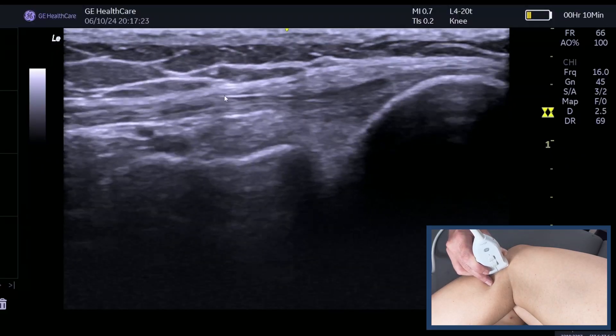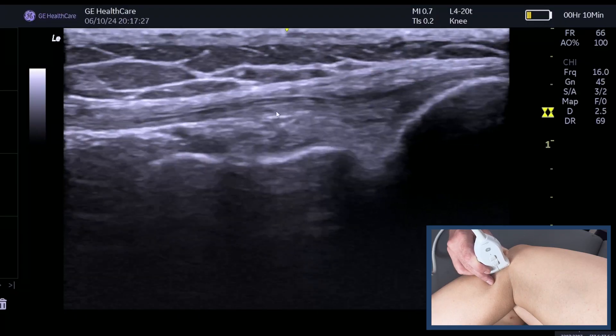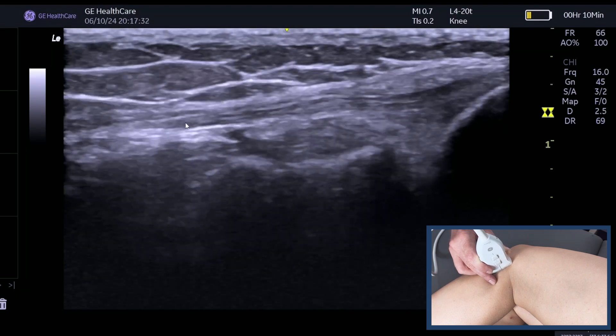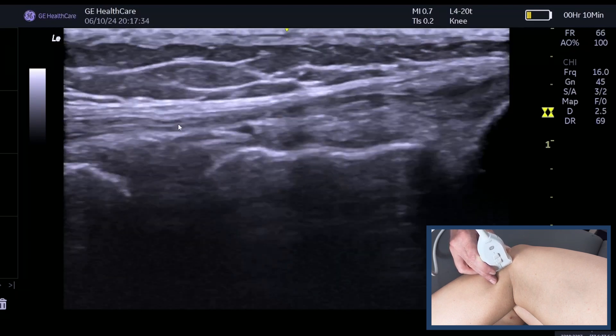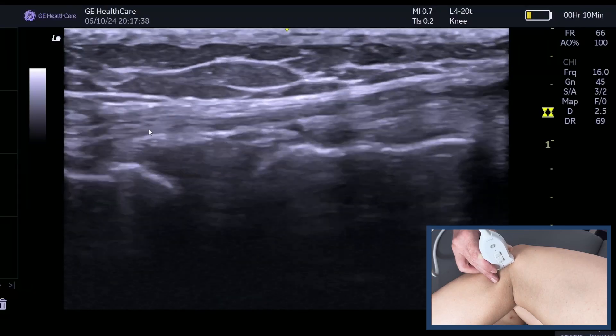You can see so far I've got this lovely fibrillar pattern attaching onto the head of the fibula, and then as I come down here, you can still see that fibrillar pattern. Can you see me just doing some subtle fishtailing to pick up that fibrillar pattern that I can still see nicely there?